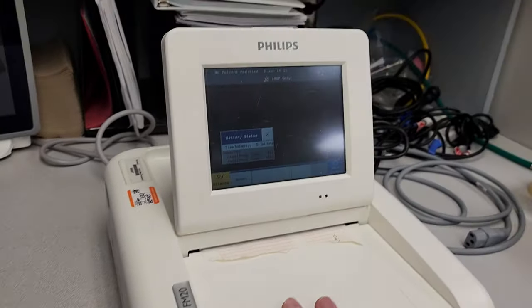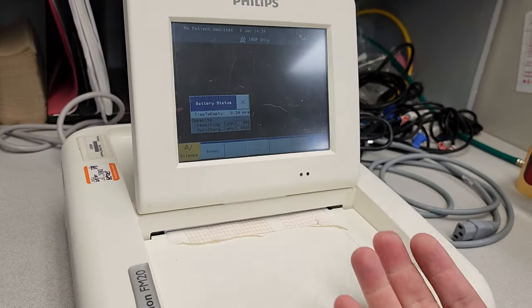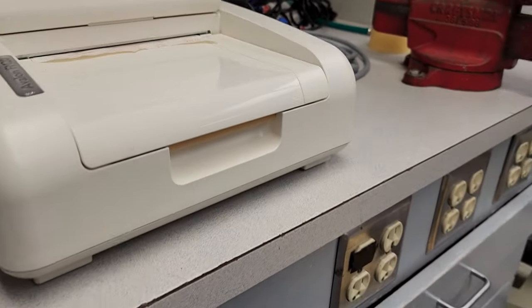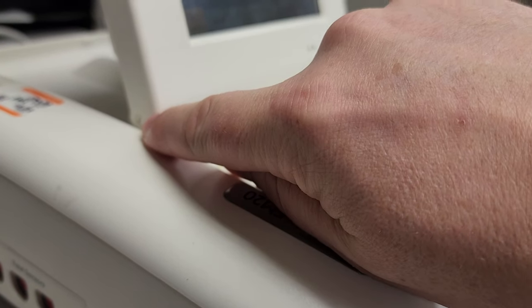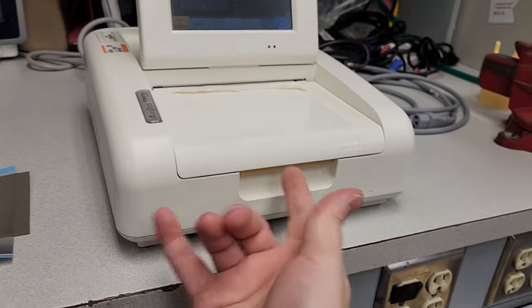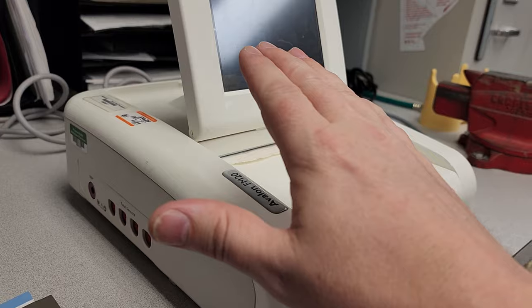All right guys, so this is the Avalon, and you're looking at a unit that actually has a good display. Now when I got it, I didn't know what was wrong with it, I just knew that it was broke. This display was all garbled, it was going absolutely crazy. And when I pulled it apart, which is simple to do, you got two screws right here, this little plastic nub and one over here, and the display kind of clamshells open. Then there's four fasteners on the bottom, they're Torx, I think they're T15. This guy comes right open.